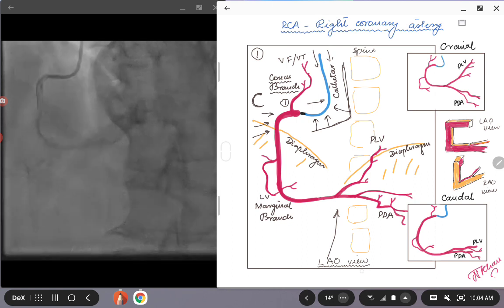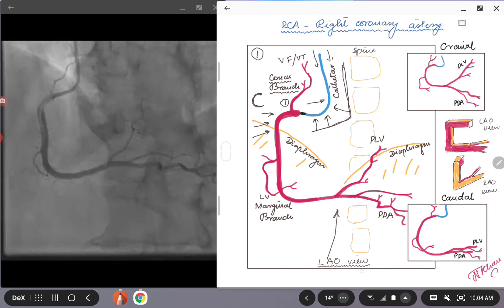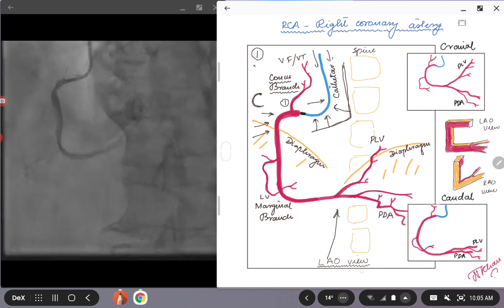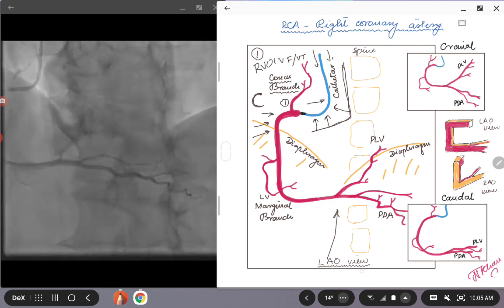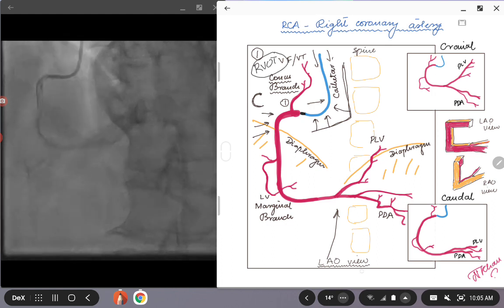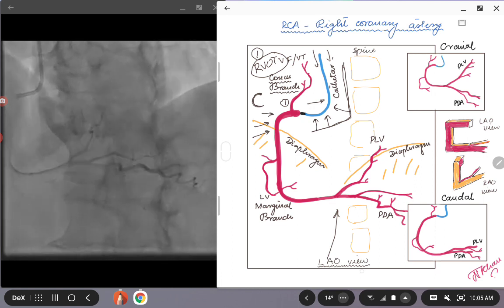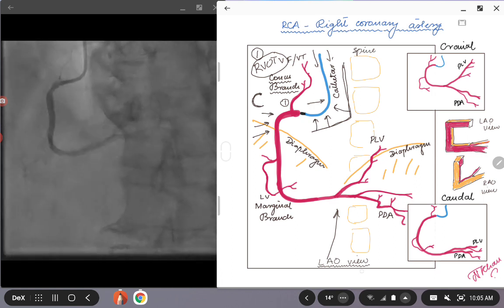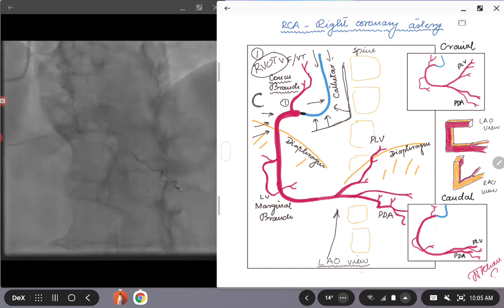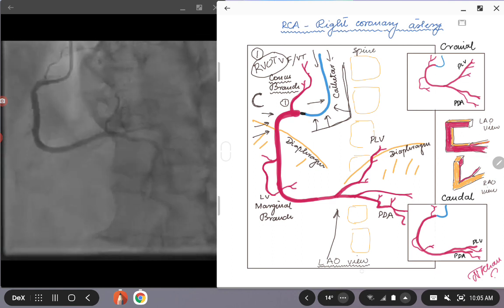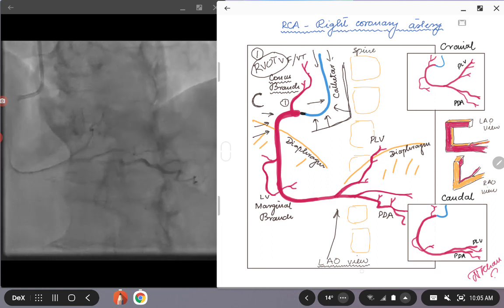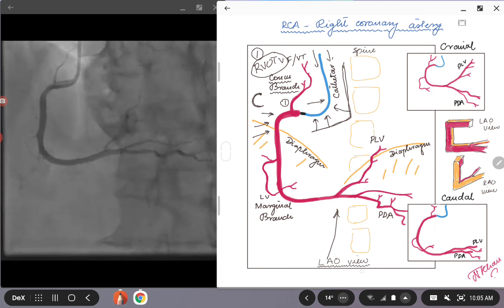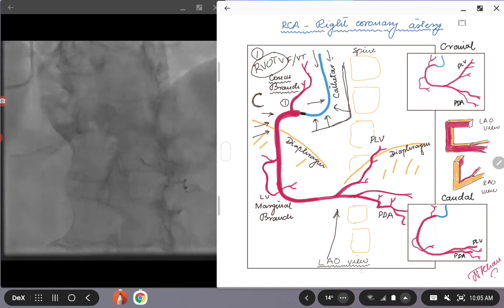We are not entirely clear, but one of the hypotheses is that the conus branch supplies the RVOT, right ventricular outflow tract. The theory is it is an area which is easily irritated and can be a nidus or a source for arrhythmias that can originate from the RVOT.